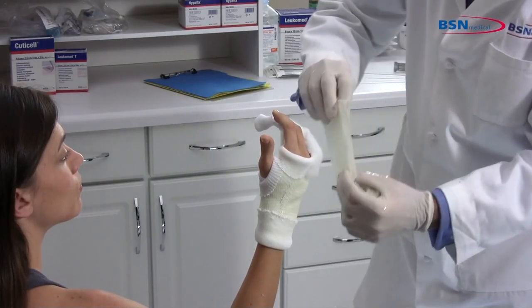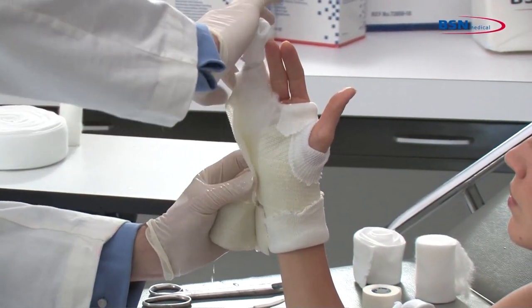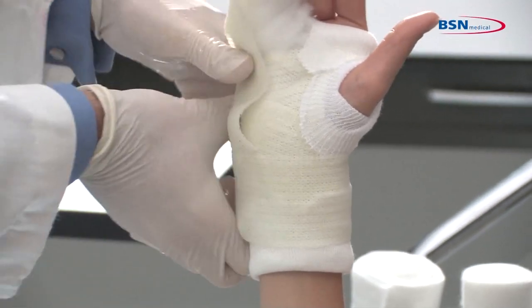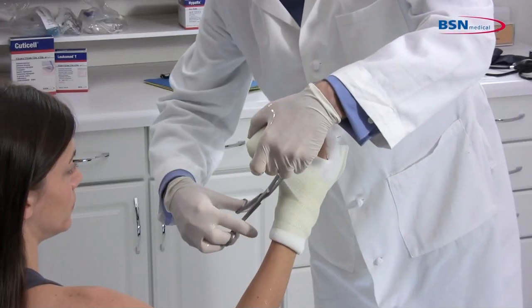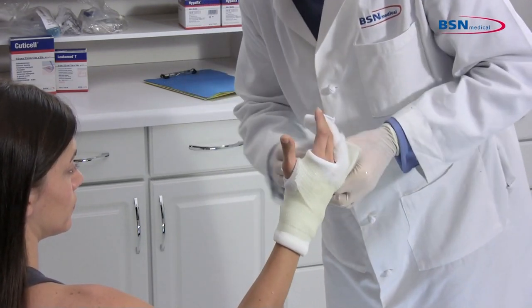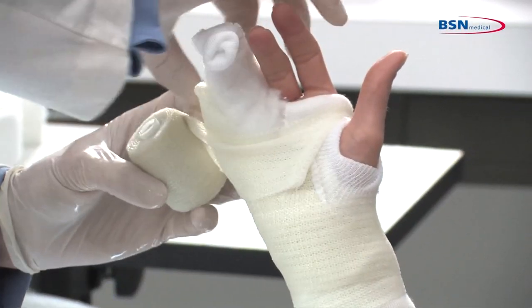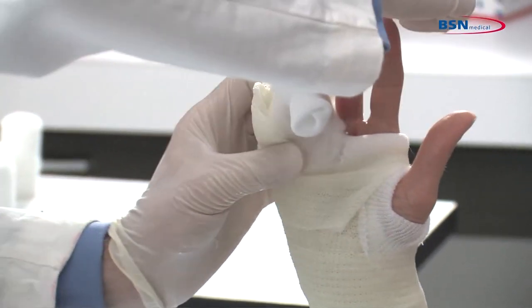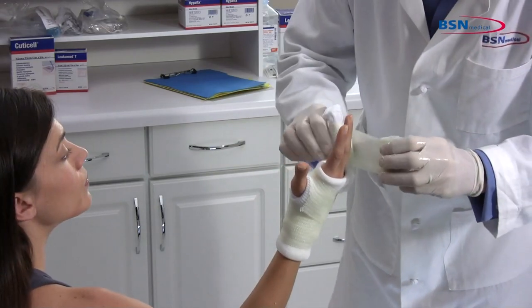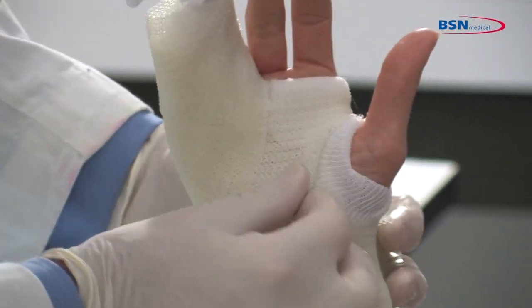Dip the reinforcement strip in water and apply to the lateral aspect of the hand and fifth phalange. Secure the reinforcement strip with the cast tape starting at the wrist. Make a cut at the thumb to easily pass through the web space. Curl the cut edges of the cast tape under to create a smoother edge. Pass twice around the fourth and fifth phalanges and continue toward the wrist. Be sure to leave approximately one-half inch of stockinette exposed to leave a soft end.